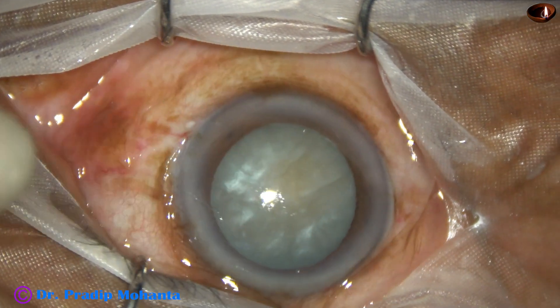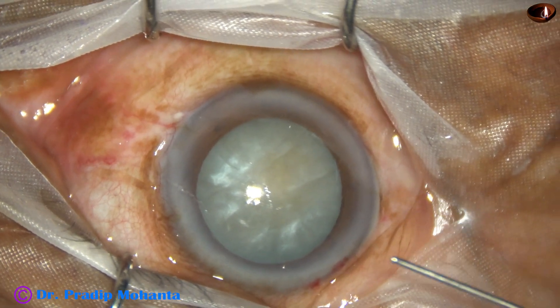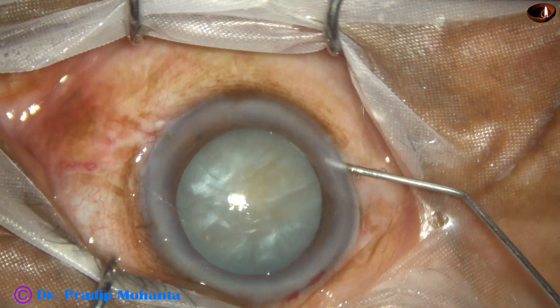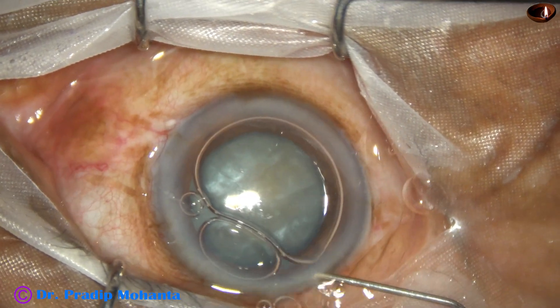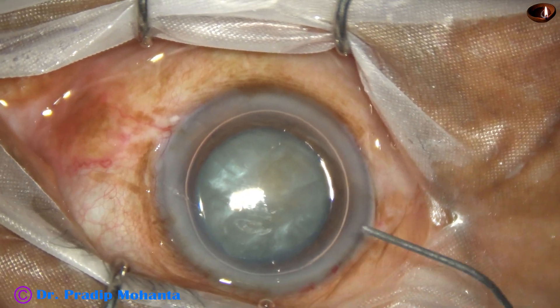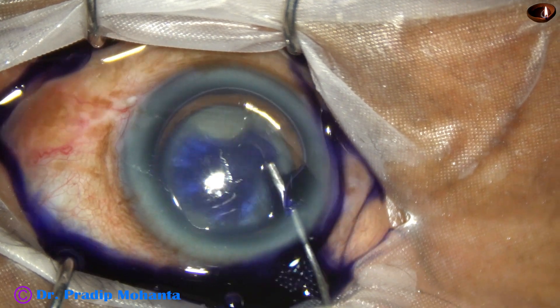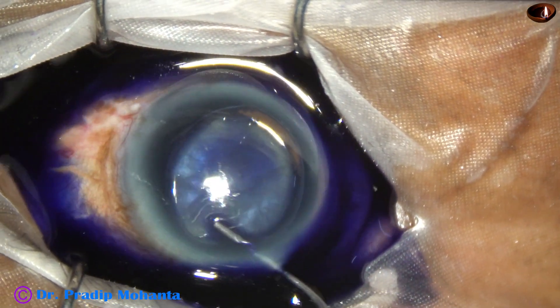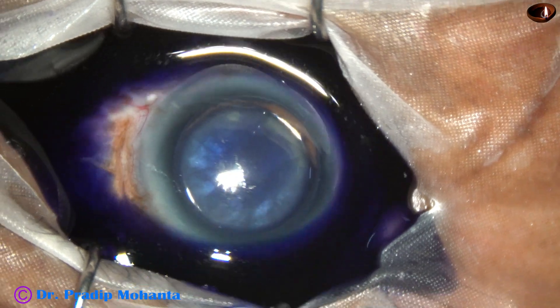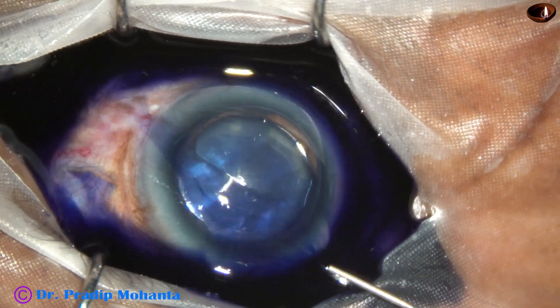And now the anterior capsule is stained with trypan blue dye underneath an air bubble. Because if we apply the dye underneath an air bubble, the staining is very nice and very quick — in 10 to 15 seconds, the staining is very nice. We must apply the dye in all parts of the anterior capsule; there should not be any part unstained.